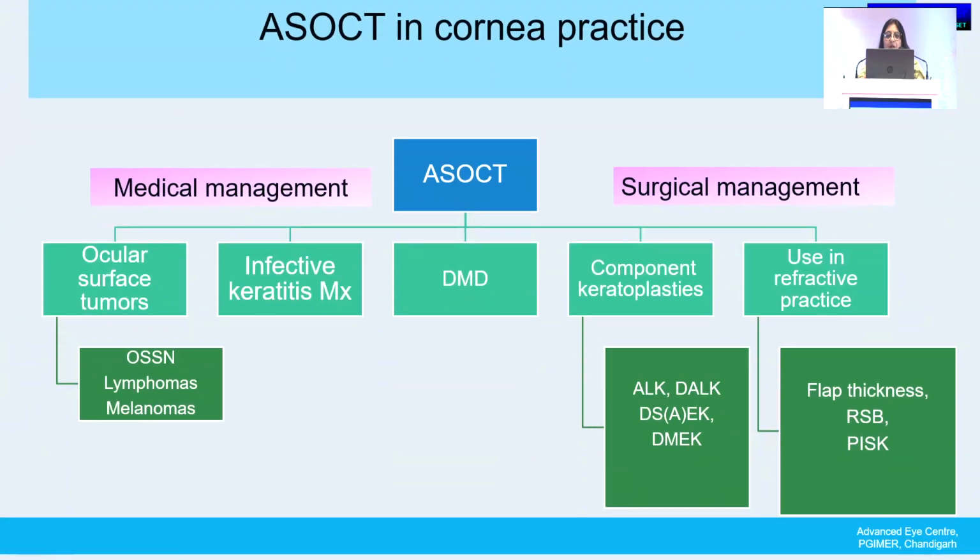Coming on to the second part of my talk, I'll talk about ASOCT in corneal practice. So ASOCT and swept source is a part of the ASOCT family. So in some situations, it would show more benefits, but otherwise it would be the same as other OCTs. And we can use it for medical management as well as surgical management. I'll just run through a few case scenarios.